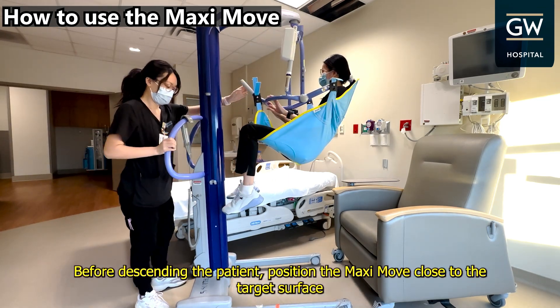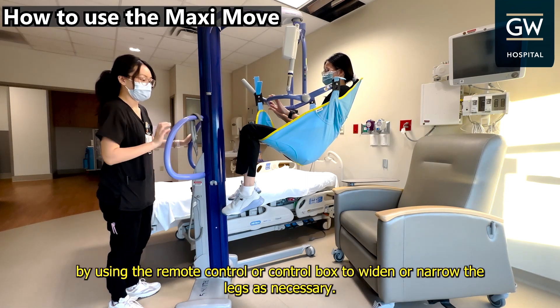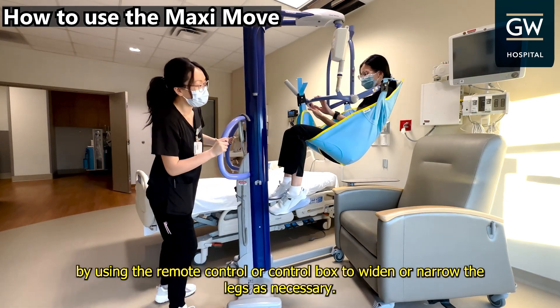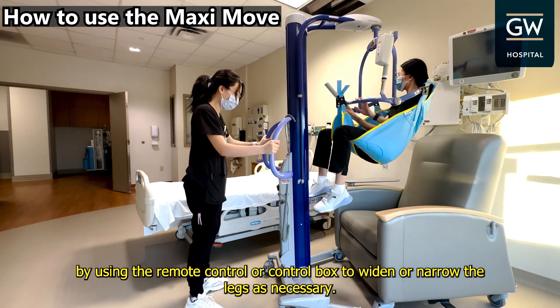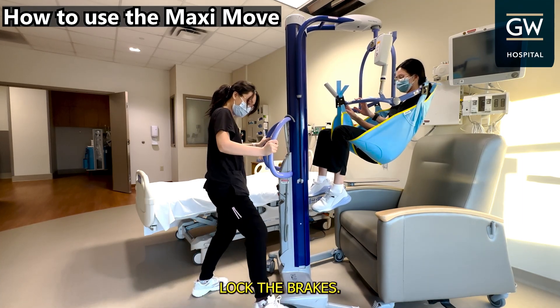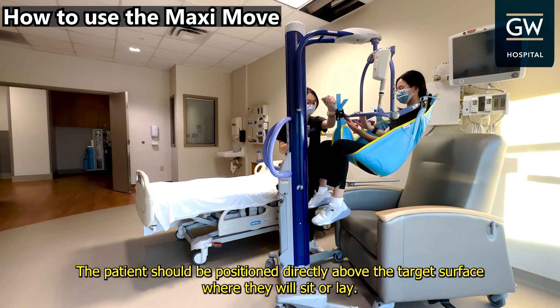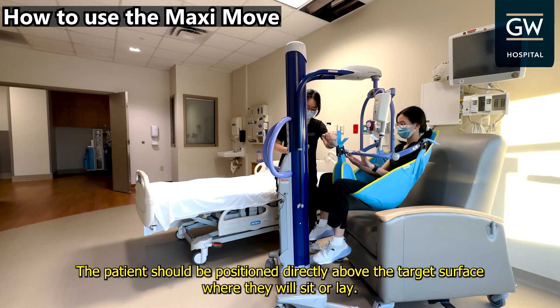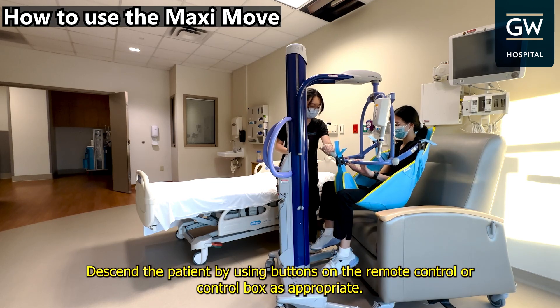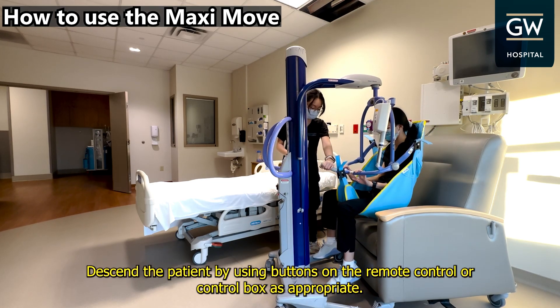Before descending the patient, position the MaxiMove close to the target surface by using the remote control or control box to widen or narrow the legs as necessary. Lock the brakes. The patient should be positioned directly above the target surface, where they will sit or lay. Descend the patient by using buttons on the remote control or control box as appropriate.